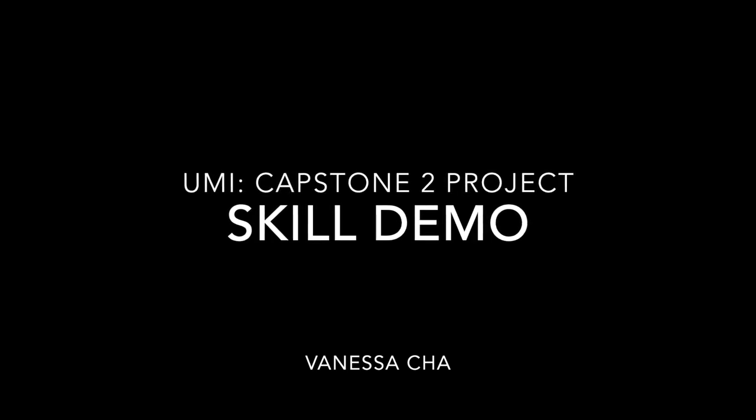Hello, my name is Vanessa. Today, in this skill video, I will demonstrate some intermediate sonology, patient prep and care, in addition to a brief vascular protocol of the aorta.